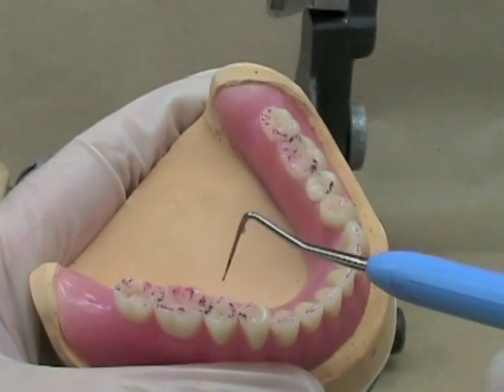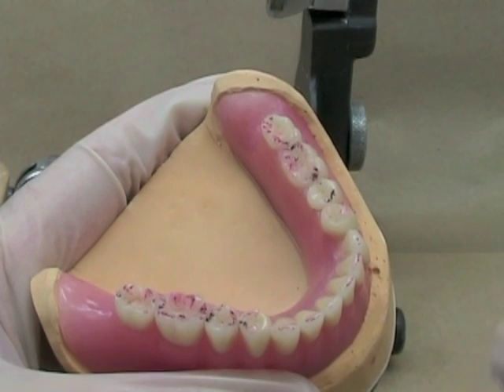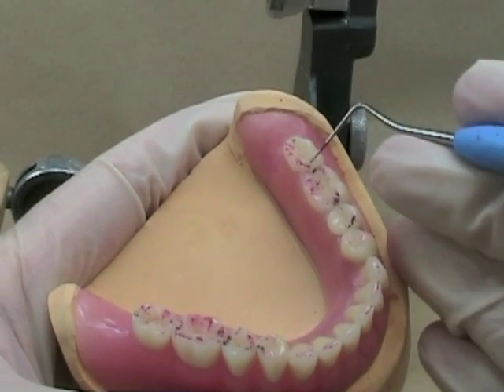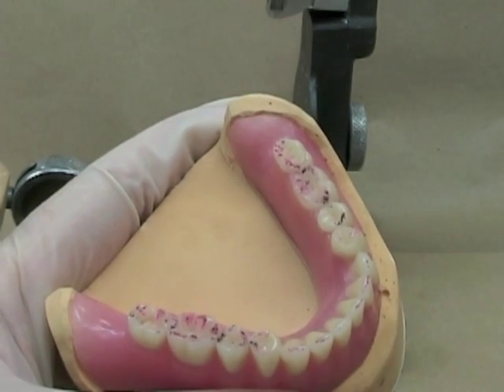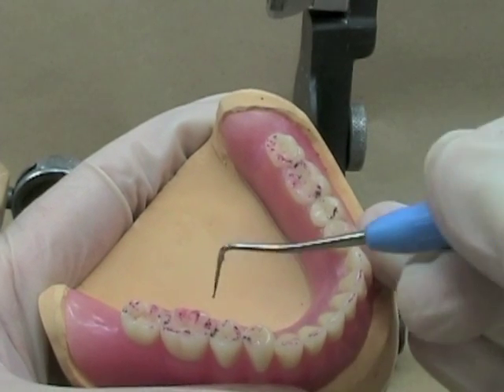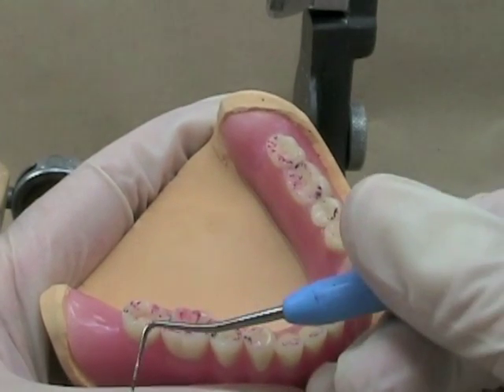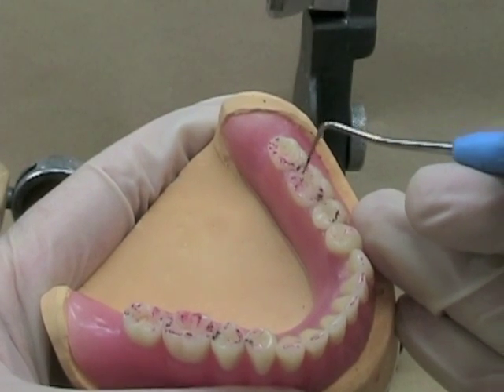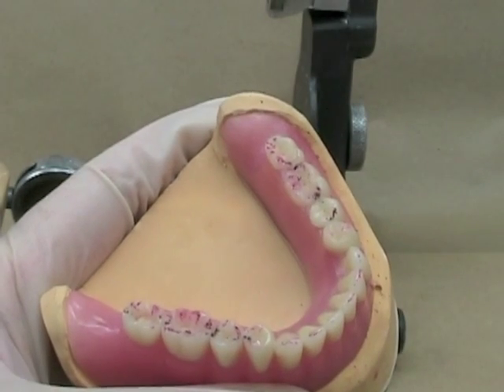A couple of principles: our working and our balancing contacts should be lines, like you see here. The balancing contacts should also be lines, not dots. We're trying to get one working and one balancing contact on each tooth. You can see we've done pretty well here — may not be a balancing contact on this tooth over here, but overall things look pretty good. One of our principles is that the balancing contacts should never be heavier than the working contacts. The corresponding balancing contacts are lighter than our working contacts. That's good.